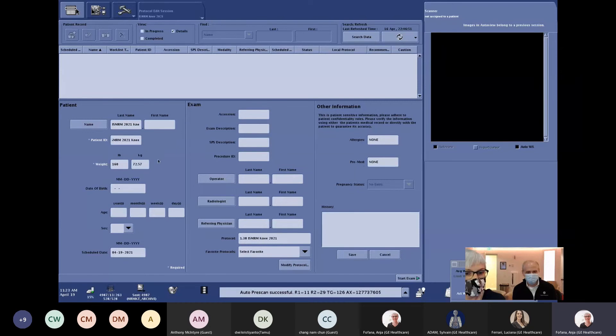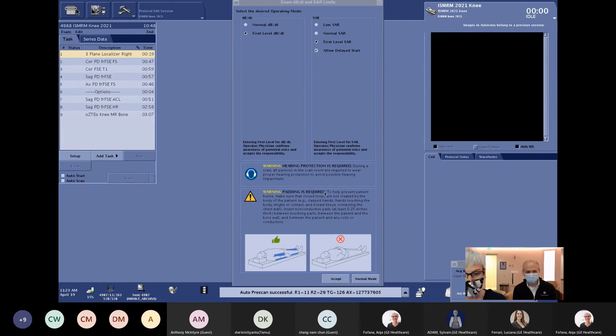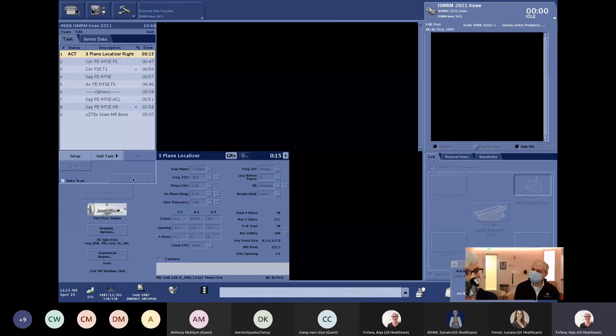Here is the name already in the protocol. We have the protocol selected, then we can go ahead and start the exam. We'll accept scanning at the first level, then run a normal three-plane localizer on the right knee. We'll show how deep learning is implemented in this software release — we have deep learning in multiple ways, and the first one we're going to talk about is AIRX for the knee.